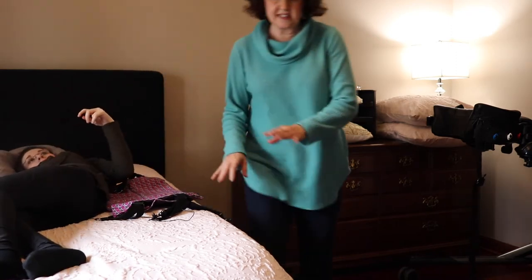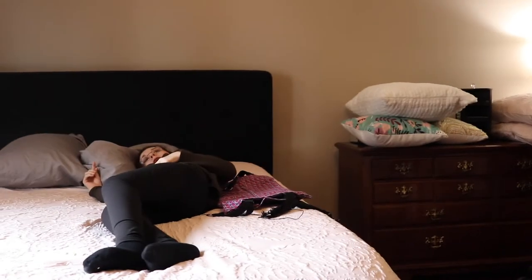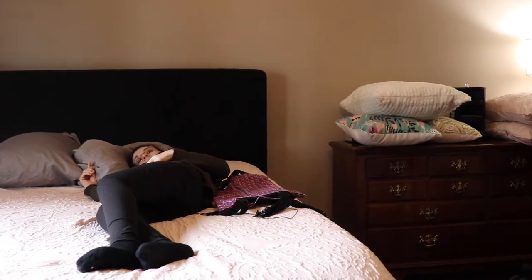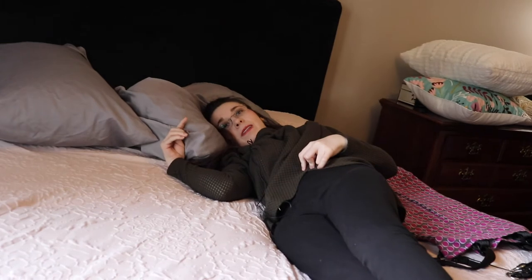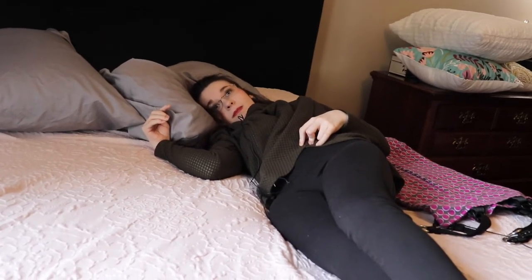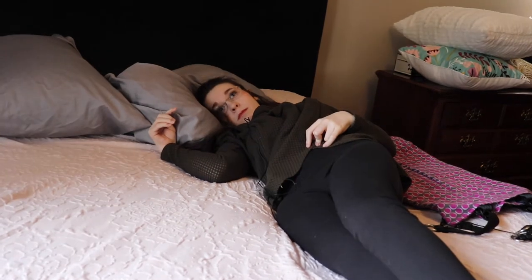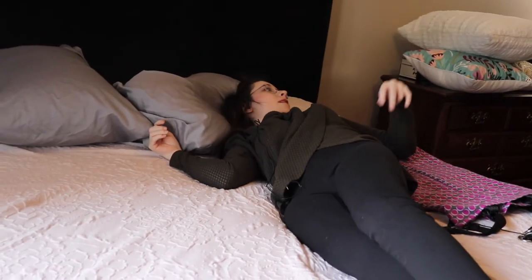Our new system — or rather the system that we are just now starting to utilize more. Okay, so now I'm going to put you in your wheelchair, and then we can do the close-up, and you can describe your piece of equipment. I just call it a walker, because it's easier.